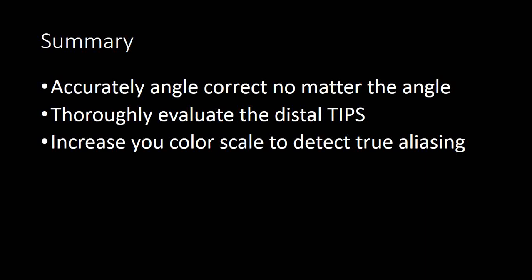There is no doubt. And I think that our ultrasonographers have the ability to get excellent studies. I see very good studies from people, but I also see studies that haven't been properly performed. And so I want us to really work on improving the consistency and the quality of our studies so that we can help these patients, help the hepatologists, and help our interventional radiologists.